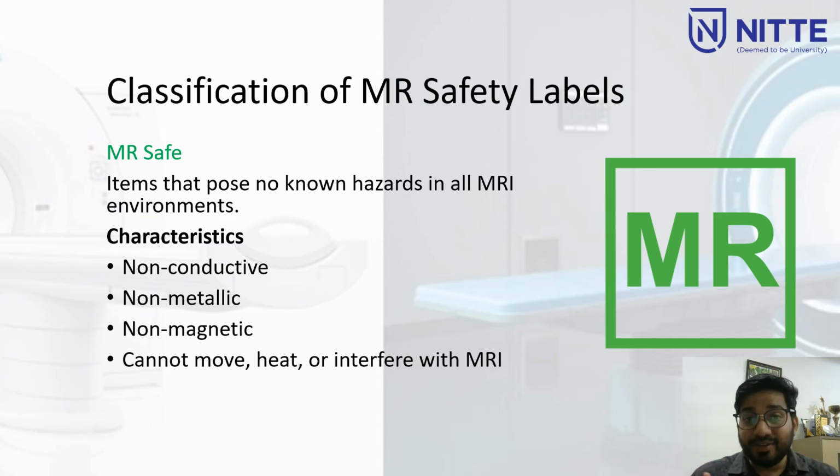Examples you can see: Foley's catheter, which is MR safe, made up of silicone and plastic components. Also plastic syringes, rubber items, non-metallic hospital equipment such as plastic BP cuffs, also plastic bed rails, etc. These all equipments are MR safe.